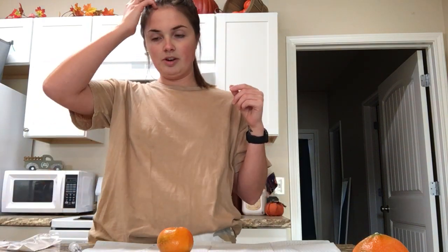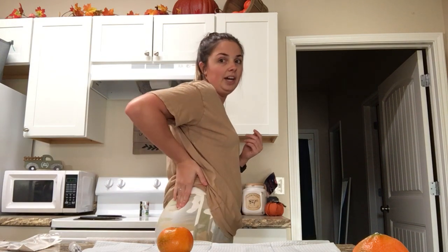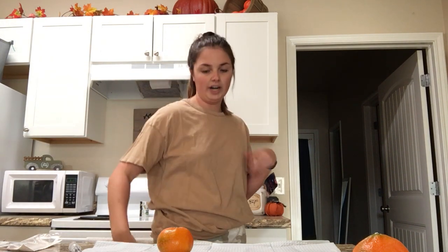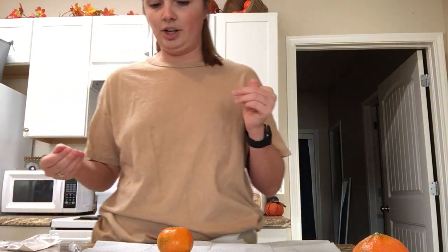So I'm also gonna tell the patient that this is gonna be injected in either like the butt area, or like we said in the video, we can split the thigh into 3 sections, and then it would go in the middle section where most of the muscle is. So I'm going to pretend that I have alcohol wipes.